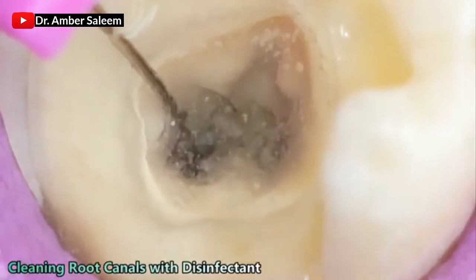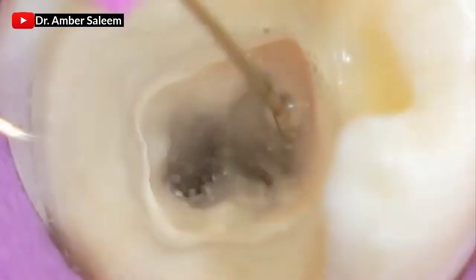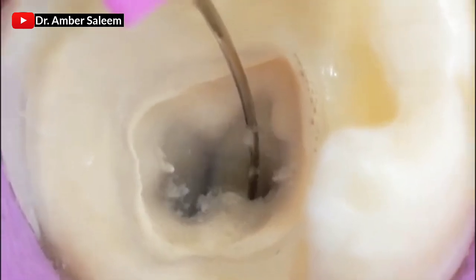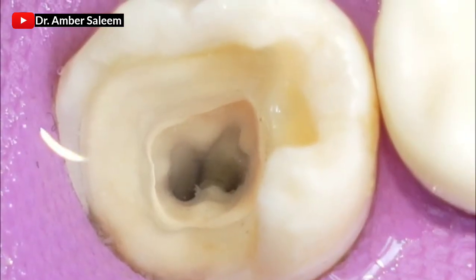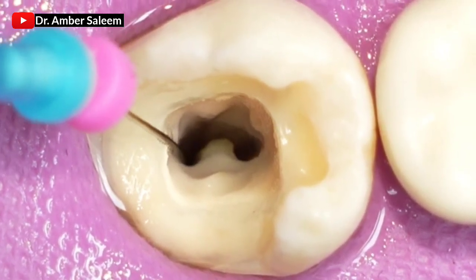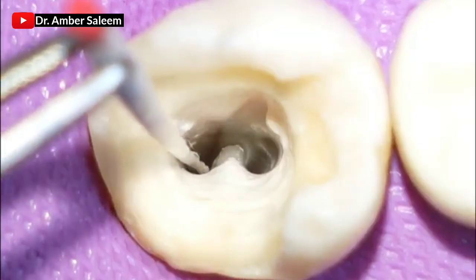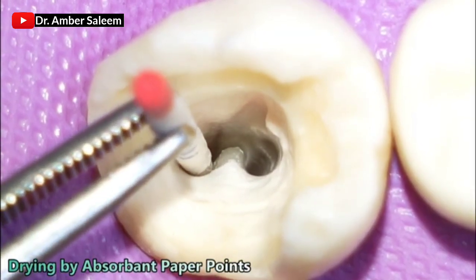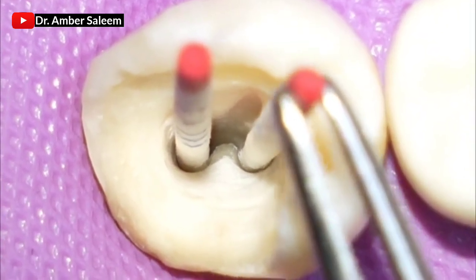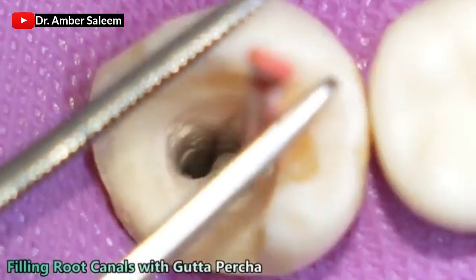Cleaning root canals with disinfectant. Drying root canals by sucking out fluids. Drying by absorbent paper points. Filling root canals with gutta-percha.